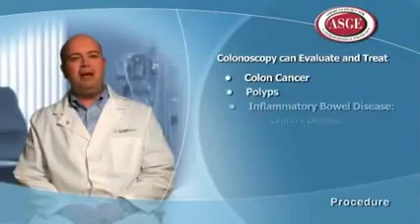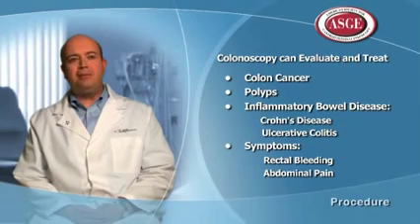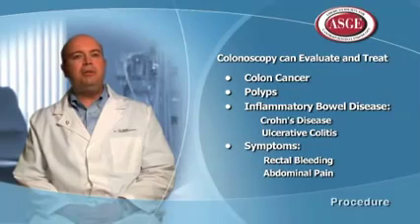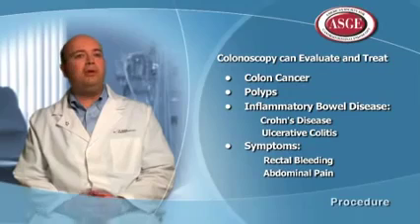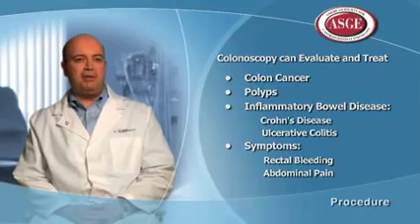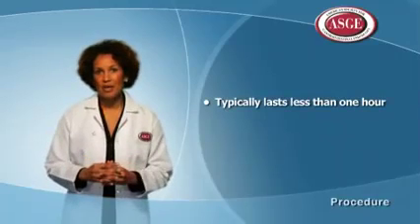Typically we're looking for different things in different patients. If it's just a screening colonoscopy, we're looking for polyps, which are little growths that can turn into colon cancer. In other patients who have symptoms, such as rectal bleeding, we're looking for a source of bleeding. In patients who have abdominal pain or diarrhea, we may be looking for inflammation or a cause of those symptoms as well. Colonoscopy typically lasts less than 1 hour.